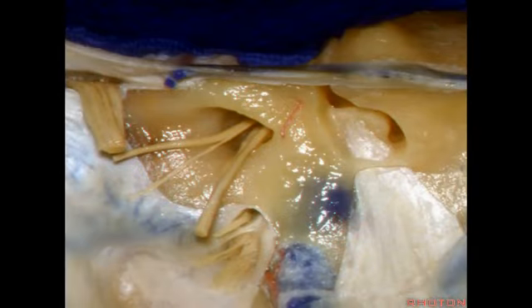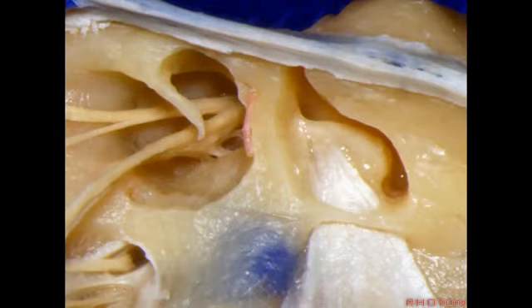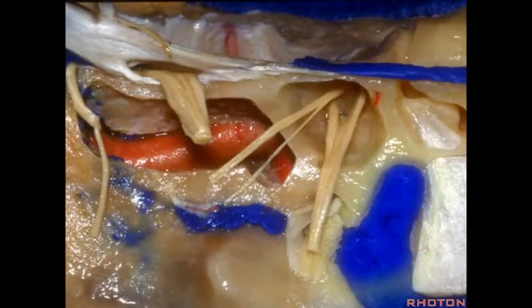When you expose, if you're wanting to avoid it, well, you can feel the endolymphatic sac. In this area, if you feel through the dura, it is going to get a little softer. And then this area under the labyrinth, if you drill this out, you see the jugular bulb here in the infralabyrinthine position. So that we've exposed the jugular bulb here. It can even extend into the posterior lip of the meatus.